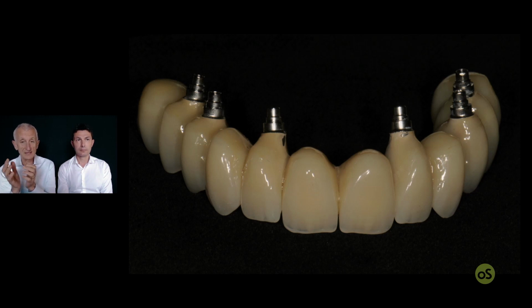And another important thing is that we let the relining material read what is underneath, okay? I mean, in the intaglio surface, okay?